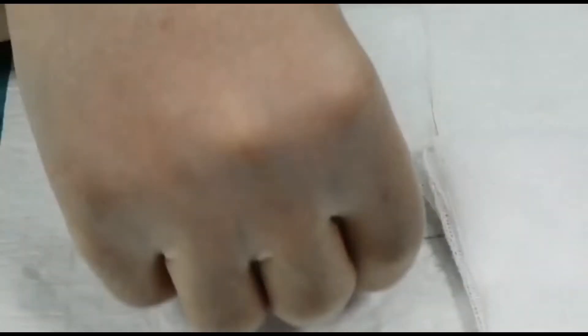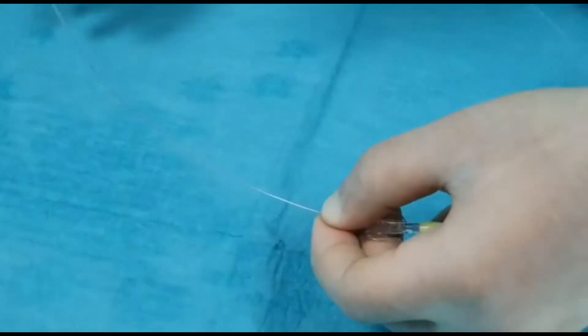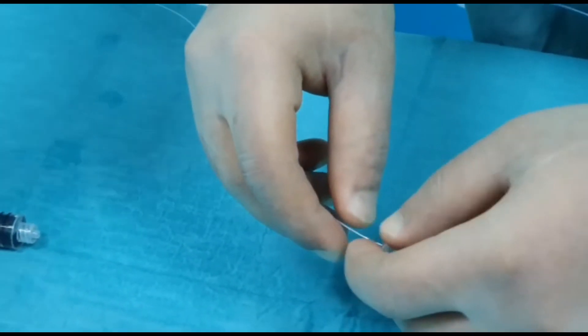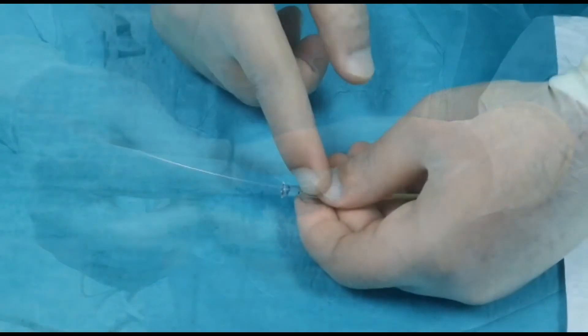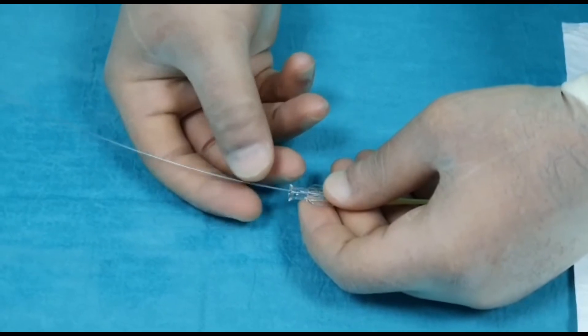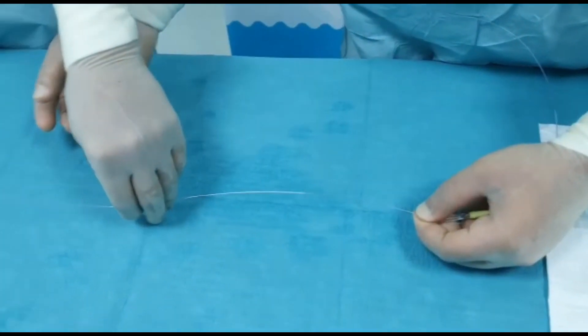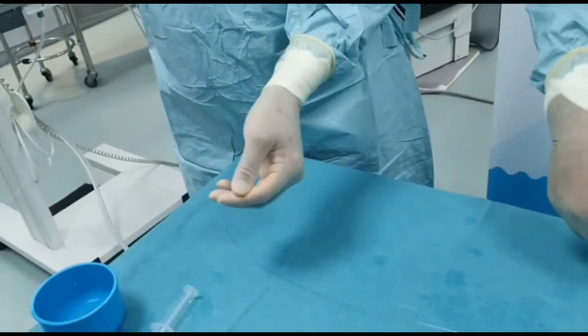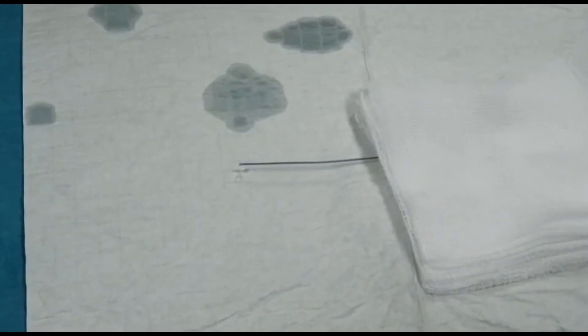Now you can pull out the hypotube while continuing to push the wire. The wire has gone all the way in. Now pull the hypotube — this is a very important step. While holding the micro catheter in position, I'm going to pull out the hypotube until I see the wire, then pull the hypotube all the way out. The hypotube has been removed. I'm going to keep pushing on the hard end of the wire until we deliver the coil to the location we want.